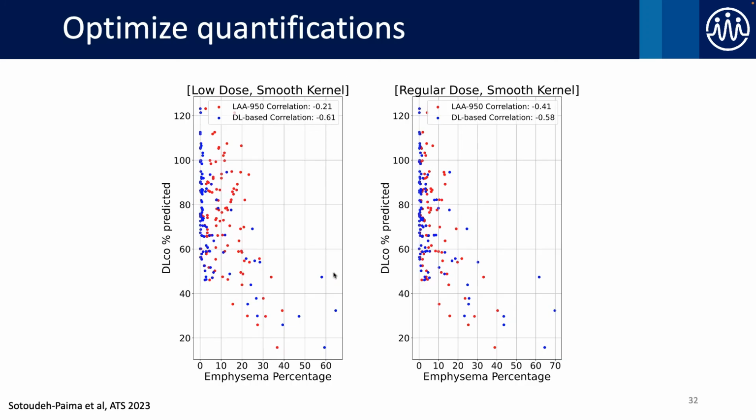and also is reflecting more of the emphysema rather than just randomly selecting some threshold points for the low attenuating regions. And this is not just with the quantification, we have also shown that it has a clinical meaning as well. So when we use our robust quantifications compared to conventional ones, we were able to predict patient outcome better.